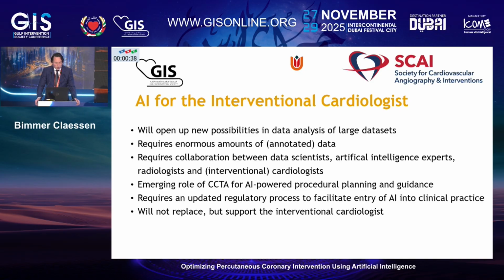There is an emerging role of CCTA for AI-powered procedural planning and guidance, and there is huge promise for photon-counting CT in this area. But it will also require an updated regulatory process to facilitate entry of AI into clinical practice, and it needs to be incorporated into our standard daily workflow. And ultimately, it will not replace, but support the interventional cardiologist.